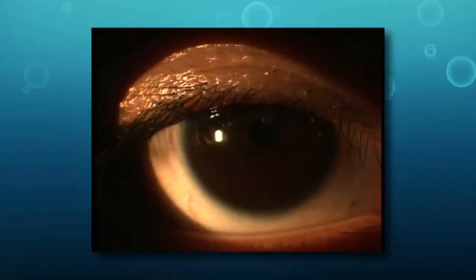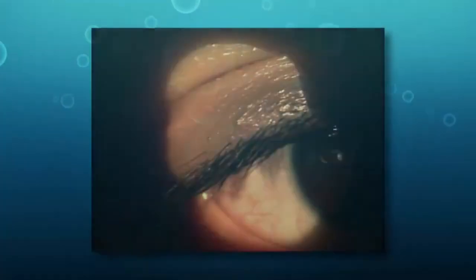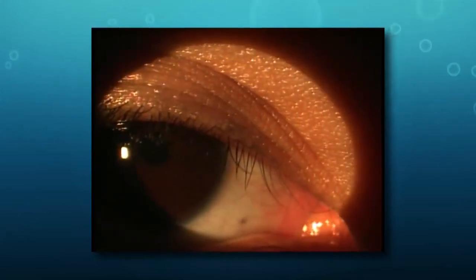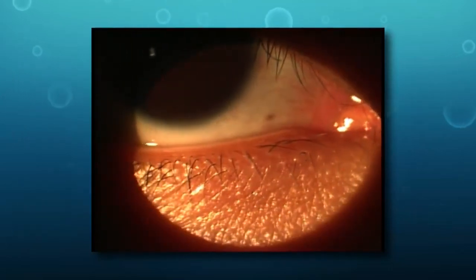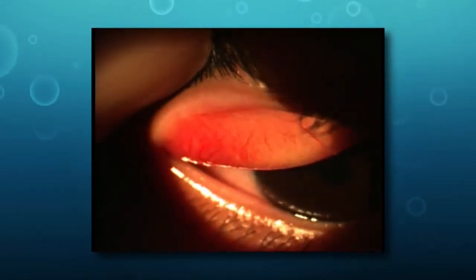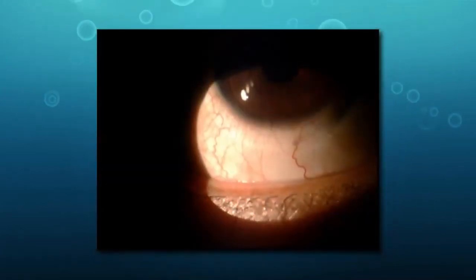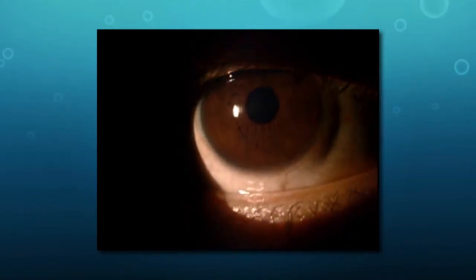Diffuse illumination provides an overall view of the external and anterior segment of the eye, for example, cornea, conjunctiva, sclera, eyelid, eyelash, and tear film. It is also useful for examining the lower and upper palpebral conjunctiva. However, to prevent the tear film from becoming unstable, eyelid eversion is better performed at the end of the anterior segment examination. It is also commonly used for contact lens fit assessment, for example, centration, movement, and coverage.